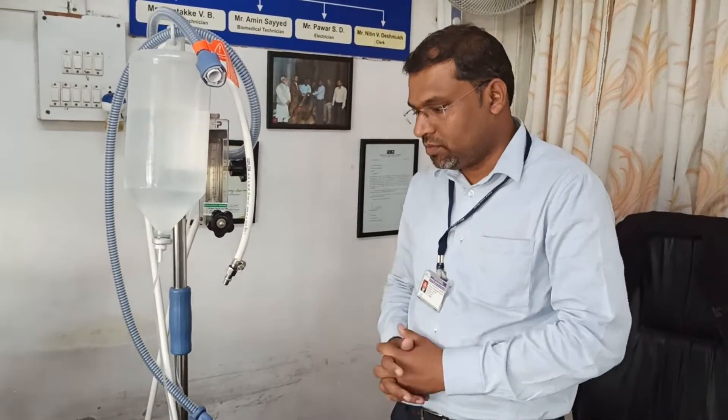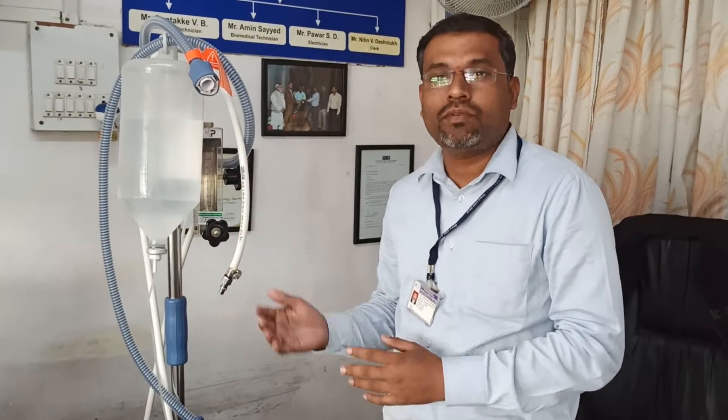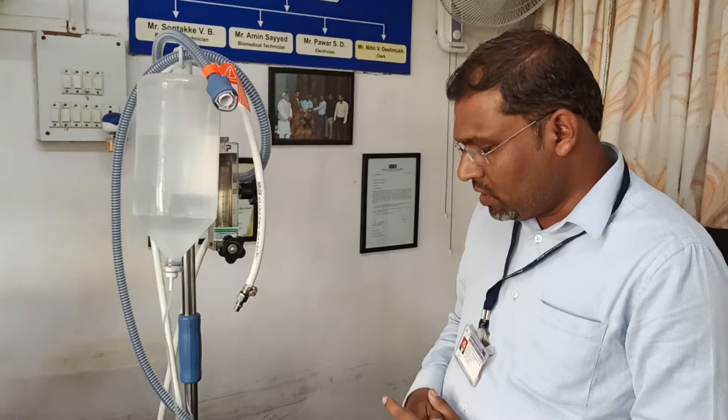Hello guys, in the last video I already told you how to use this machine. Now in this video I am going to tell you how to disinfect this machine. Once you have used this machine on one patient and you are going to apply it to another patient, before that you have to disinfect the machine.